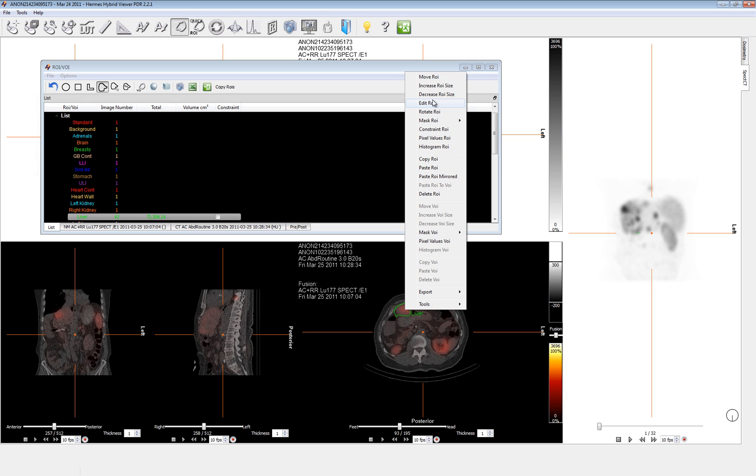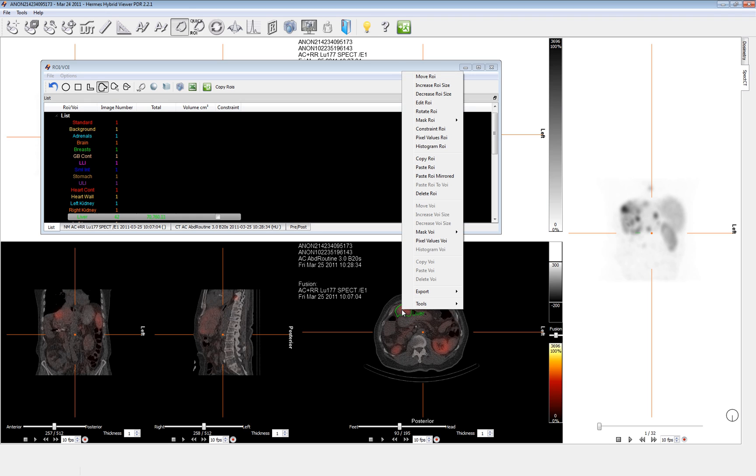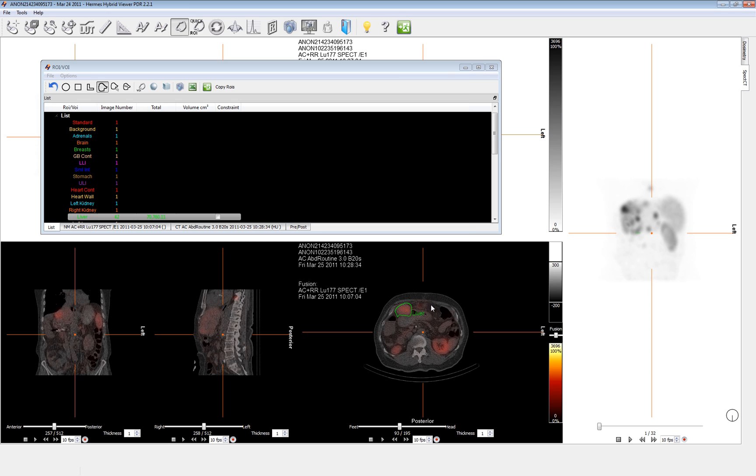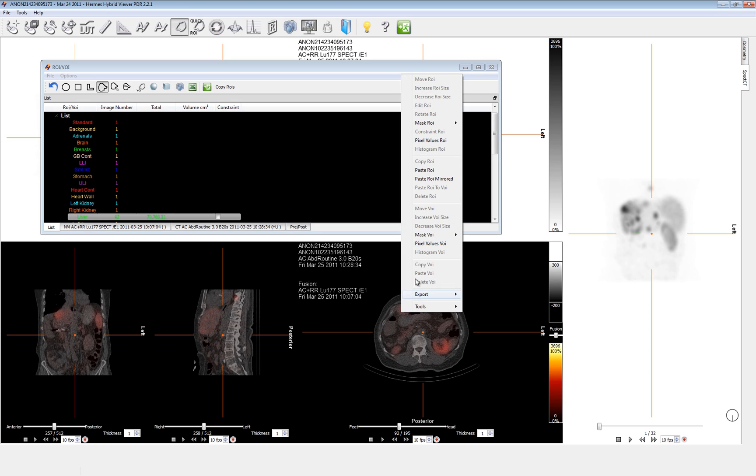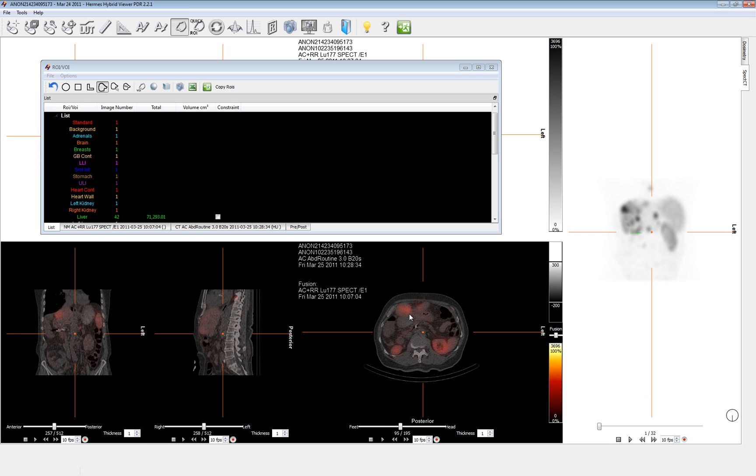We could also delete the ROI completely if we wanted to redraw it. We can move it if it was in the wrong spot and even copy it and move it to the next slice, if that was actually appropriate. So we have one slice of the liver. I'll continue to draw just a couple more to get to the next part that I want to share with you.